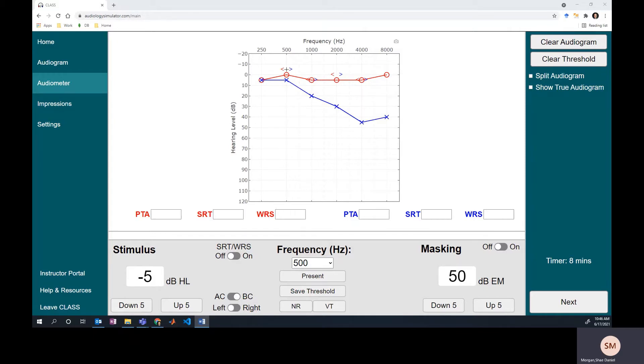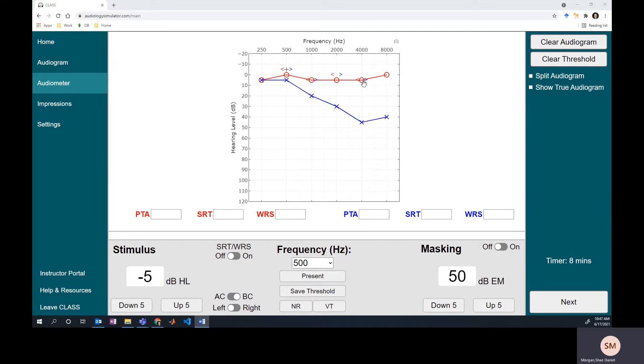In this video, we're going over how to effectively mask when finding air conduction thresholds. We've already decided that we need to mask at 4,000 and 8,000 hertz because the level of the air conduction stimulus in the left ear might have been loud enough to be heard through bone conduction in the right ear. So we need to cover up or mask that right ear so it can't hear the sound that is crossing over from the left side.